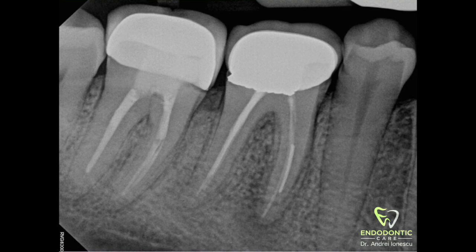So what's our game plan here? First of all, we've decided we're only going to be treating the mesial root of the tooth. There's not enough evidence to say there's infection on the distal root, so the decision was made to leave the distal root alone. Second, we're going to be cleaning the gutta-percha coronal to the broken instrument, as well as in the mesial buccal canal which doesn't have an obstruction.